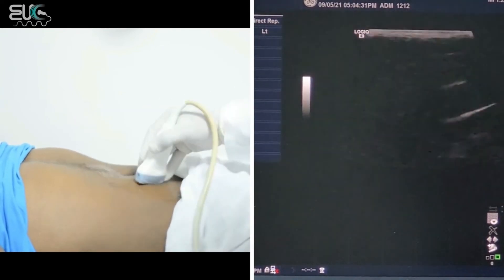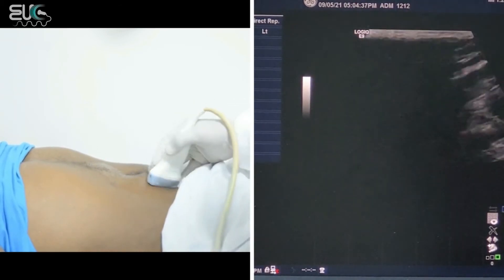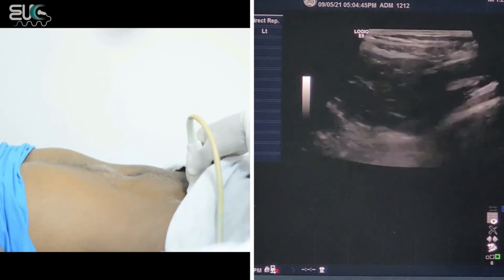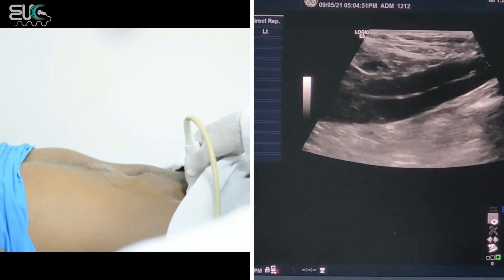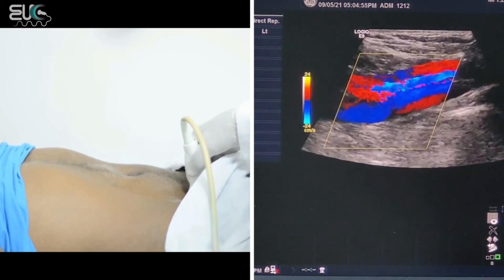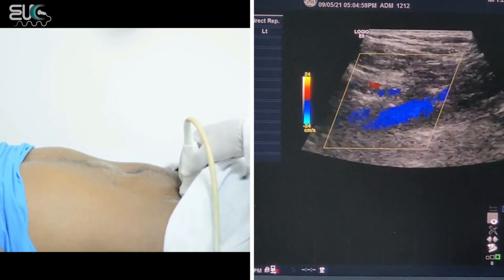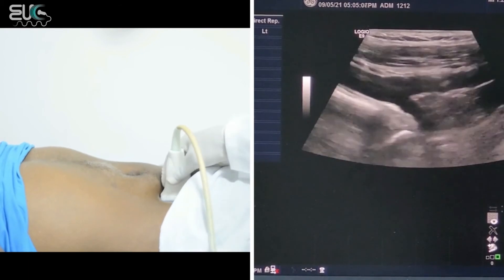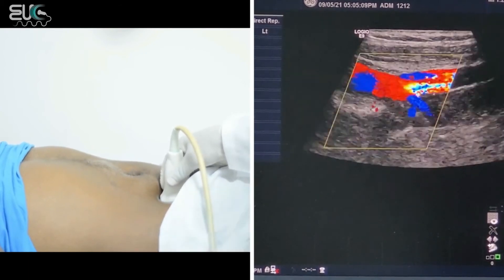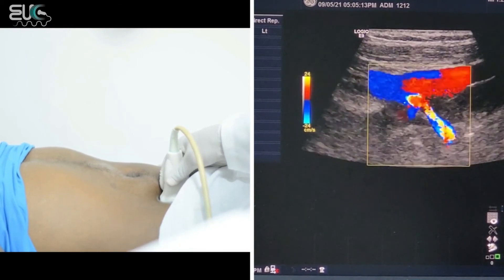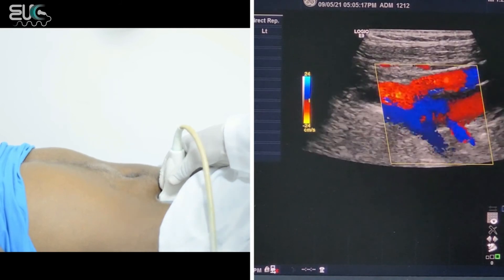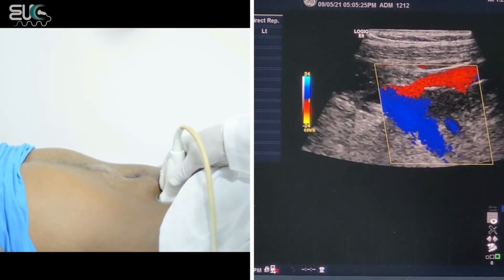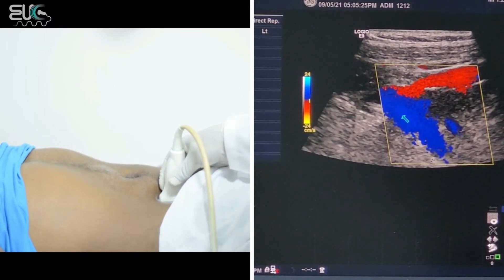After finishing the external iliac artery, internal iliac artery, common iliac artery, and the aorta, now I will follow the venous system. As I go more distal, now I'm over the external iliac vein, which will be at the bottom of the screen. Then as I move, I try to get the internal iliac vein — I have to steer the box.